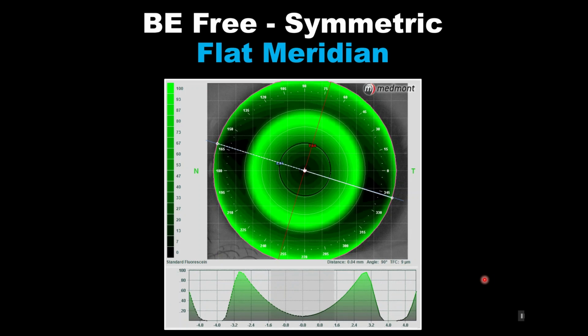And what we want to do is start with the flat meridian. And here we have our alignment with the eye surface at around 9:30 on the clock face. Then at 3:30, we have our alignment again. You notice a deep reservoir. This must be a high minus lens construction, probably a -8 lens design for this particular patient.